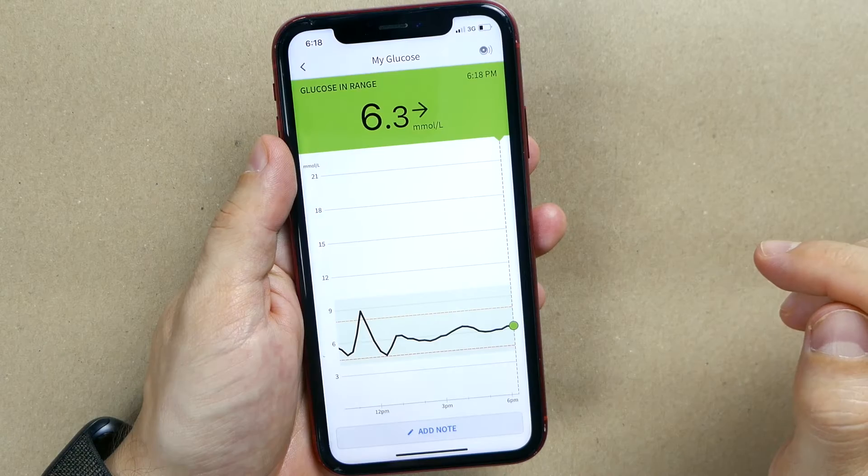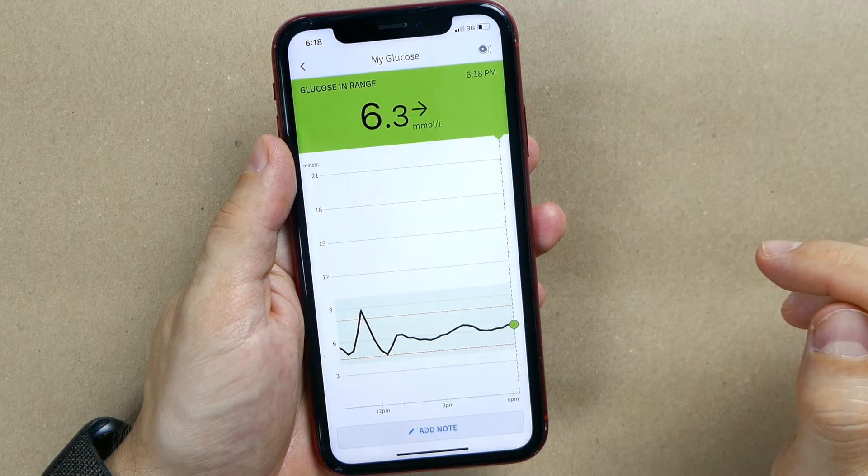I made a small correction, took some insulin, and waited 30, 60, 90 minutes checking the app — still above 200 with no idea whether I was still going up or coming down. Eventually I had to pull out a glucometer to check my actual blood sugar, but even then I still didn't know which direction I was heading. Not having the trend is a huge disadvantage. I feel like they must have limited the range on LibreSense on purpose so diabetics don't use it. So this is a clear point for Libre 2.